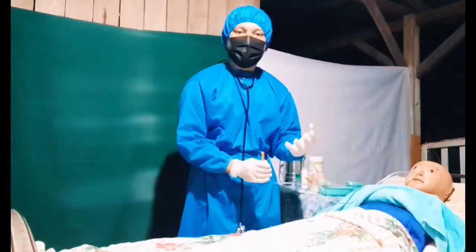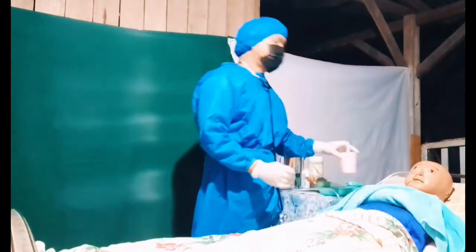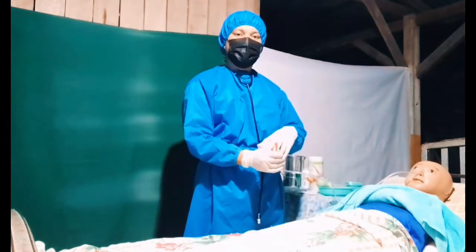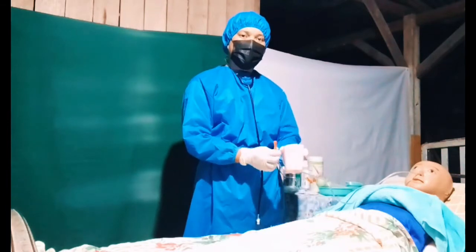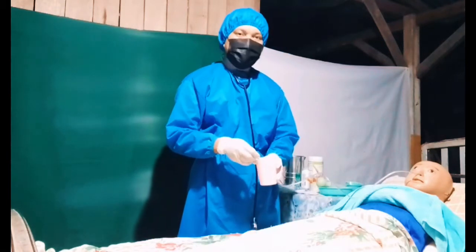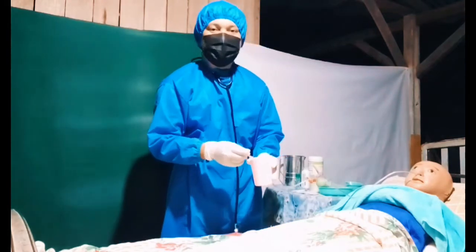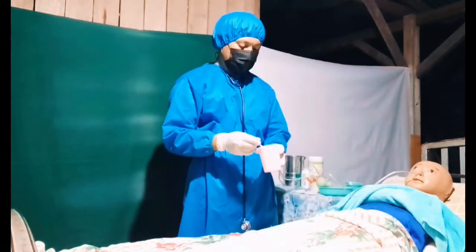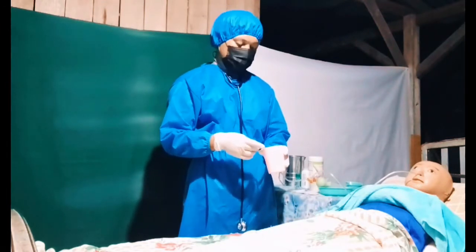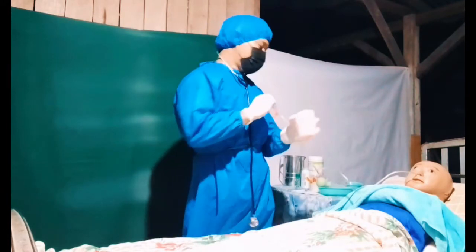Another procedure in checking the placement of the tube is to get a glass of water and submerge the tip of the tube into the glass of water and see if there's a bubble. If there is no bubble, that is good, but if there is a bubble, that indicates that the tube is in the lung, and notify the doctors quickly. So there is no bubble.